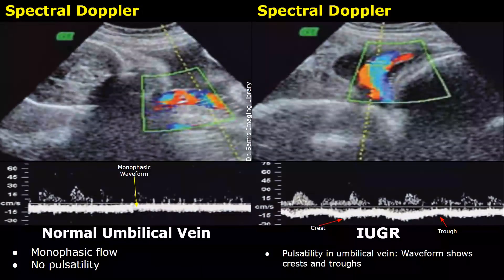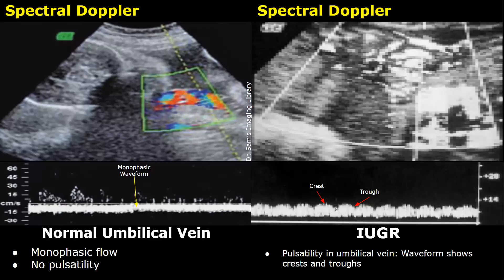Pulsatility in the umbilical vein, seen together with the previously mentioned features, can indicate IUGR. The normal umbilical vein has a steady venous flow without peaks and troughs — it is a smooth waveform. When pulsatility is present, the waveform shows prominent crests and troughs. Note that the pulsatility in the umbilical vein must be present without fetal movements or hiccups, as such movements can also cause pulsatility — so ensure hiccups and fetal movements are absent during umbilical vein evaluation.